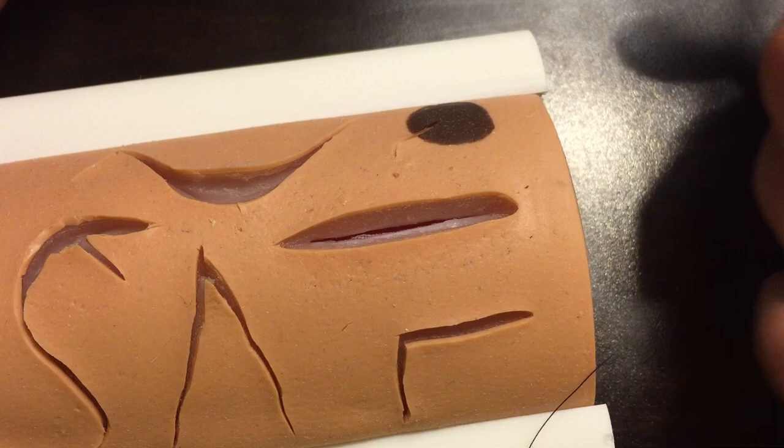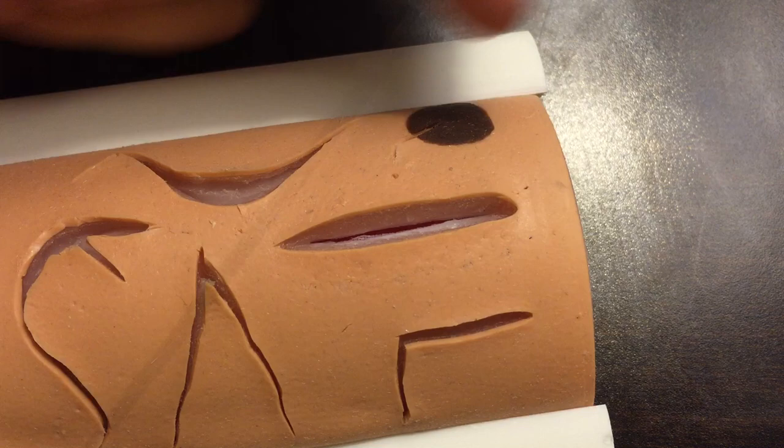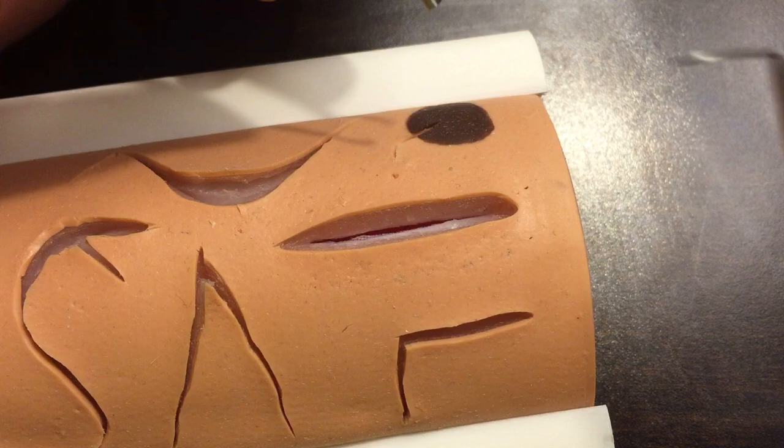I've chosen to use a larger black suture today rather than a 5-0 monocryl. Monocryl is a clear suture that's difficult to see — it looks like very small fishing line. Anyway, to start this off we need to anchor our suture.